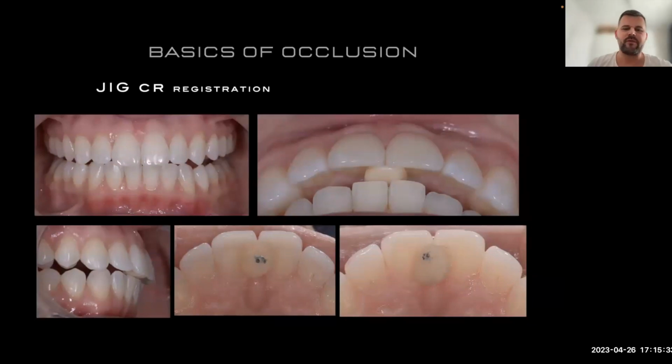When I'm talking about jig registration, I can make this myself using composite, like in these pictures. But of course, I know that we can also use the Kois deprogrammer or Lucia jig. It depends on you, what you want, and how long you want to keep this in the patient's mouth. And of course, the most important thing is to find a repeatable position of the mandible.